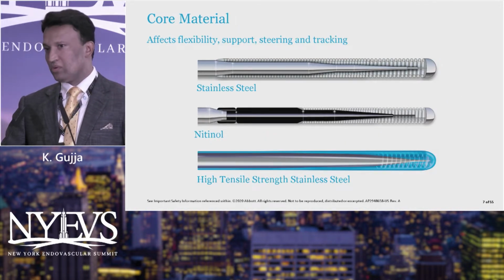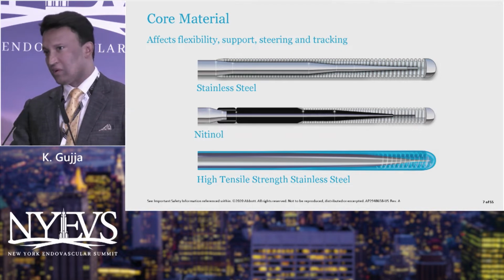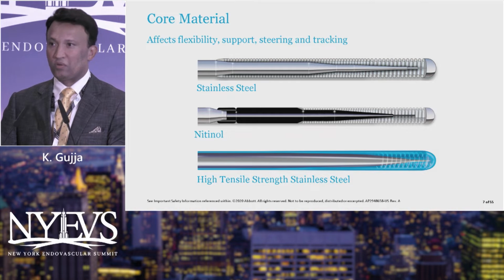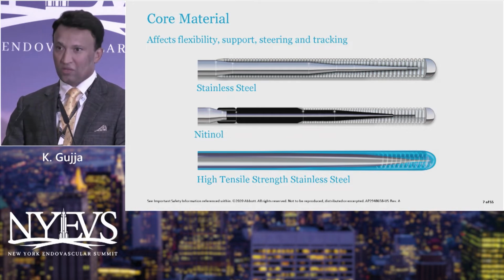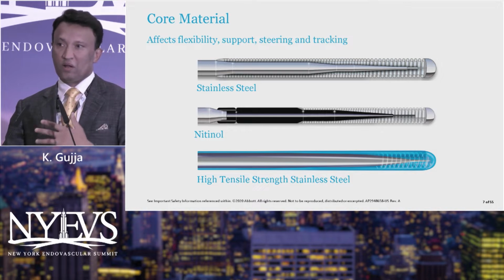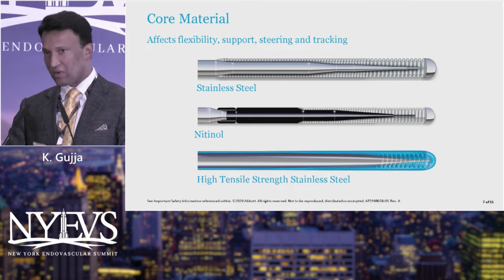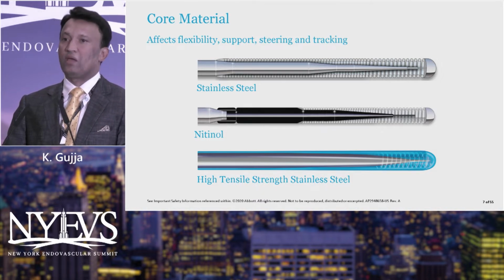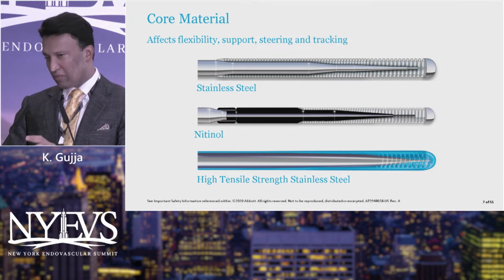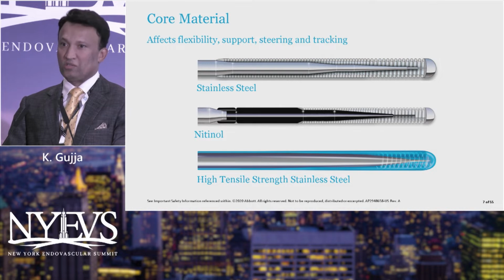So what to use when? Now that's when it comes, right? If you make the decision quickly and are pretty clear about what kind of wire you want to use, the time to do the case goes down, and it's much easier to decide so that you don't have to go in and out with the equipment a lot. And that's where this talk comes into play. It's just to let you know what wire to choose, instead of continuing to try wires, which is going to keep causing you a problem.